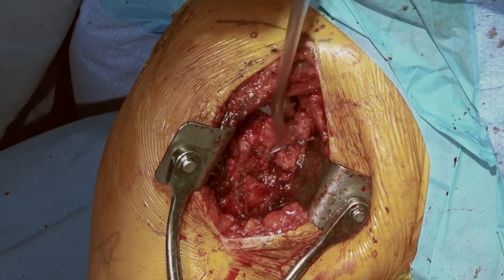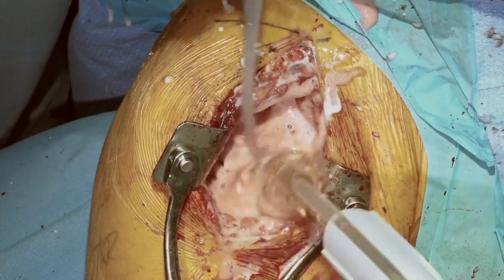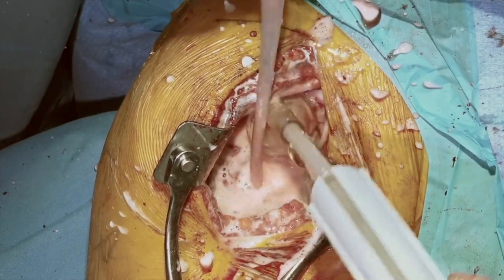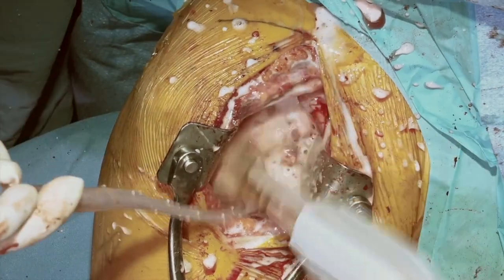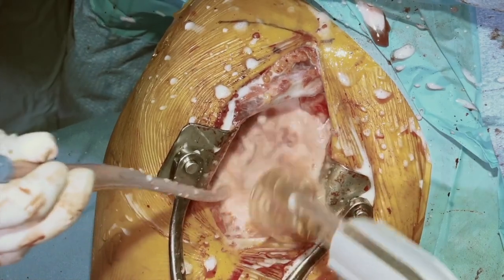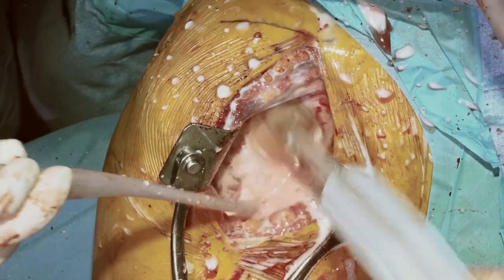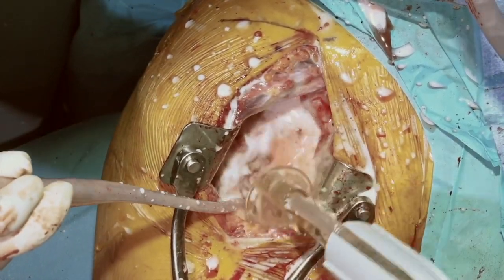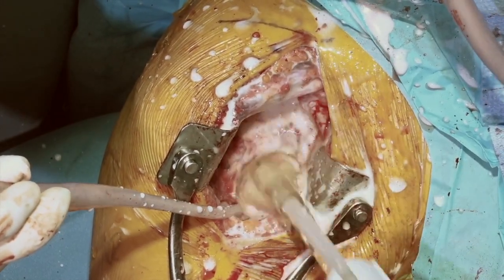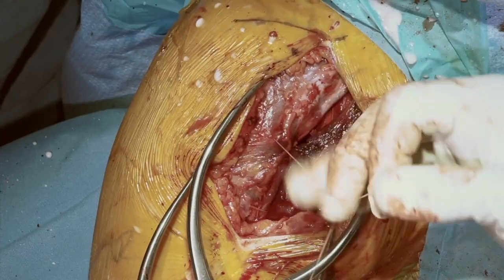We'll take our pulsatile lavage and do a final washout. In some cases where it's a procedure done after another procedure, we can consider the use of antibiotics in the cement or placing antibiotics in powdered form over the top of our implant. This patient had one procedure, there's been no history of infection, and overall the tissues looked in excellent condition — so we won't provide any additional antibiotic prophylaxis beyond the typical antibiotics before we started and for the 24 hours after the procedure. We'll repair our deltopectoral interval.